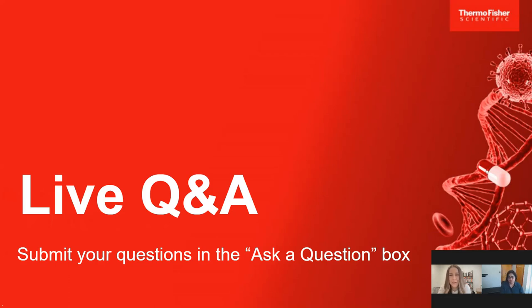Is it possible to perform multiplexing staining with amplification using fluorophore conjugated avidin? Yeah, you can do that. There should be no problem doing multiplexing with fluorophore conjugated avidin. Make sure you do it sequentially. Don't try to do all three or four multiplexing antibodies together. Do it in a sequential manner and in that case you can do it.